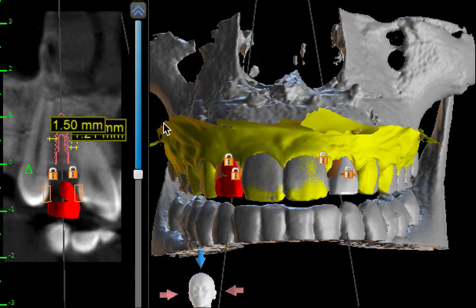And it may look okay now when this particular individual is in their early 20s, but think 10, 15, 20 years down the road. These are the cases where these teeth continue to erupt, bringing the gingiva down, and our implants are still up there, and now we're dealing with an unaesthetic outcome. Always something to keep in mind when these cases are planned, digitally or not.